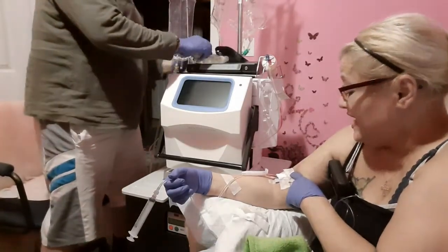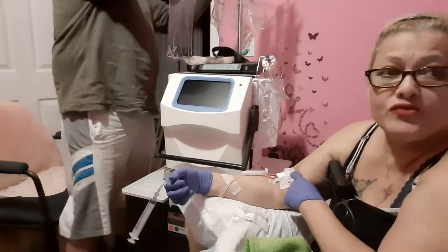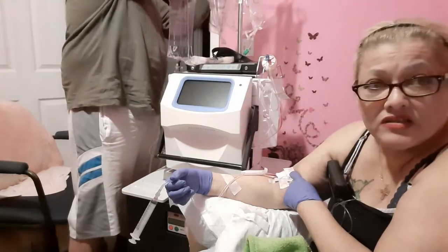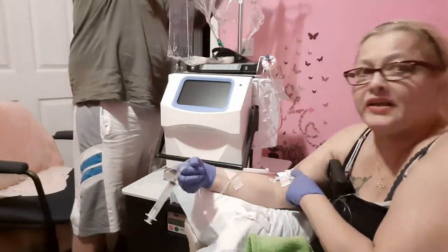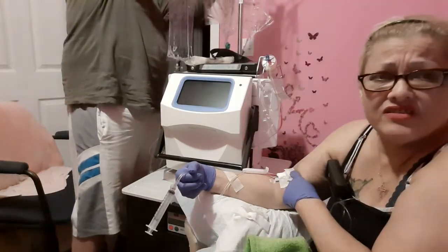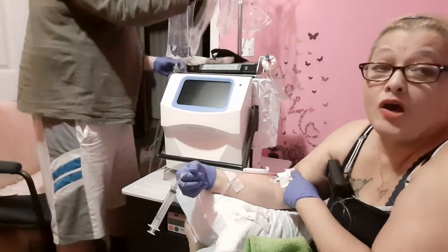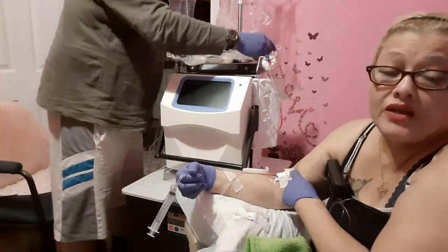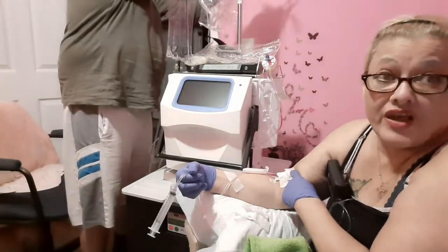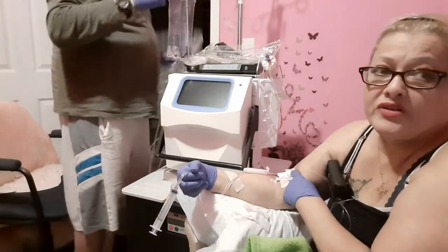Now I did have an alarm in the middle of treatment because my venous line started to slip out. I had to push it back in and double tape it because for some reason it just keeps wanting to slide out. I don't know if it's the pressure that moves it or what. So Hubby and I discussed it and we decided we're going to go ahead and start using chevrons to secure that needle so it doesn't slide back out. That'll be in the next treatment.